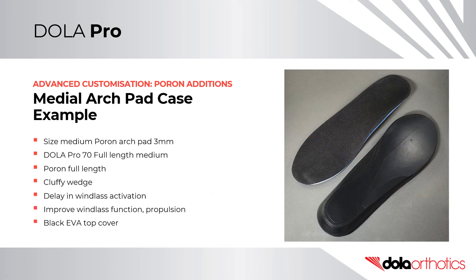In the third case example, a size medium 3mm Poron arch pad was placed on a size medium 70 soft density full length orthotic shell. The prescription was completed with a black EVA top cover, full length Poron mid layer, and a Cluffy wedge. The Cluffy wedge was used to address a delay in windlass activation identified on gait analysis and clinical assessment, with the aim of improving first ray function during propulsion and promoting windlass function.